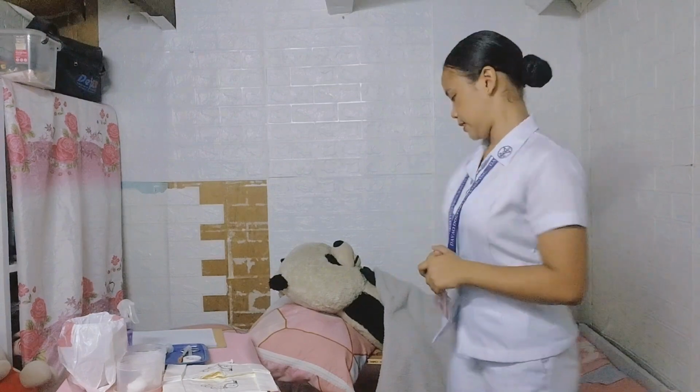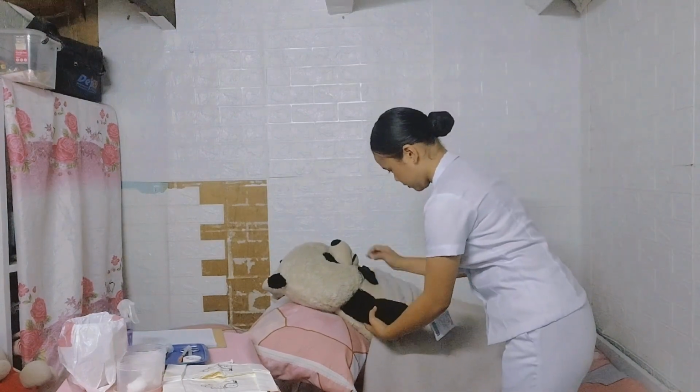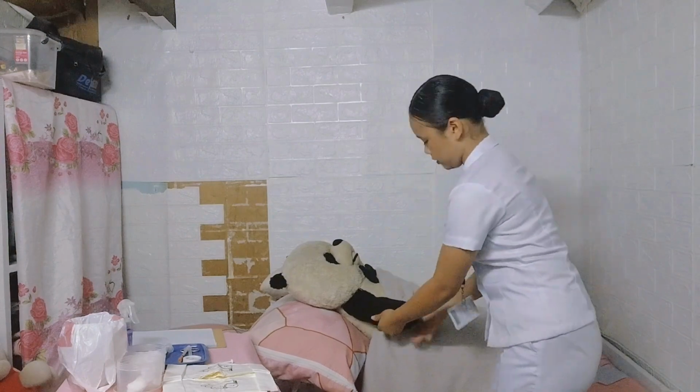Now position the patient's arm so that his elbow and forearm are supported on a flat surface. Now select the site 3 to 4 finger widths below the antecubital space and one hand above the wrist.